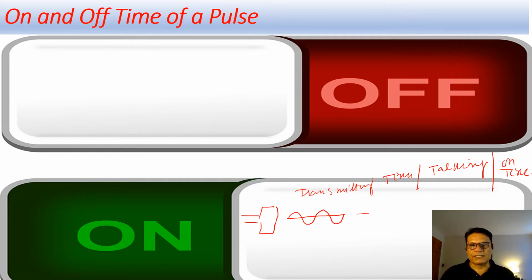So here the pulse is on, and after producing this pulse, it becomes silent and waits for the return of the echo of the first pulse. When the echo is received by the transducer, it sends the next pulse.